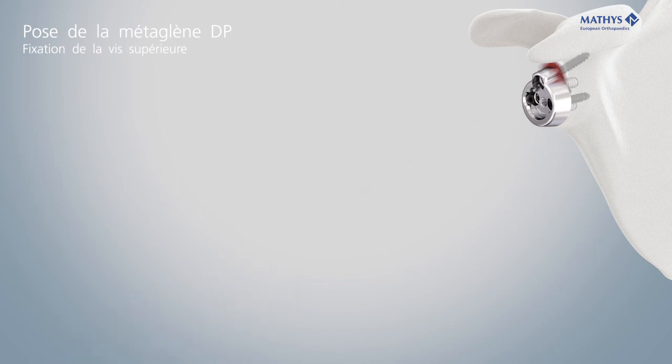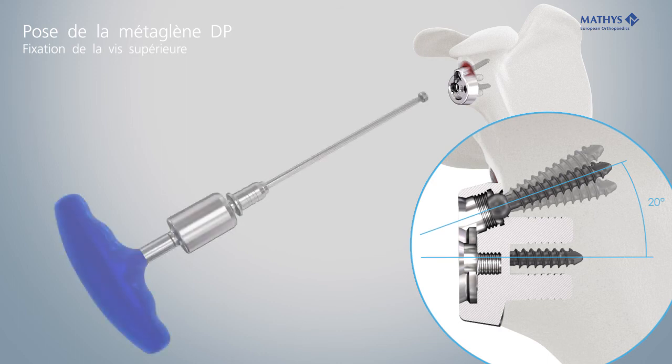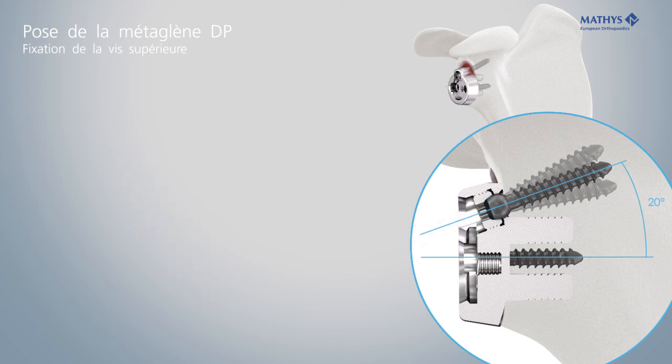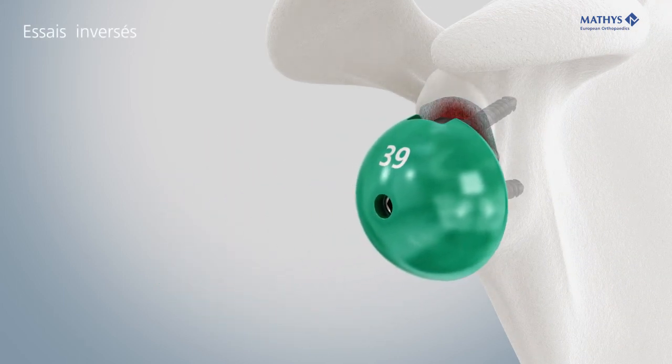Align the locking cap with the neutral screw orientation of 20 degrees and the concave side facing the screw. Tighten the cap with the torque wrench until it clicks. The trial glenosphere can be mounted and secured for a trial reduction.